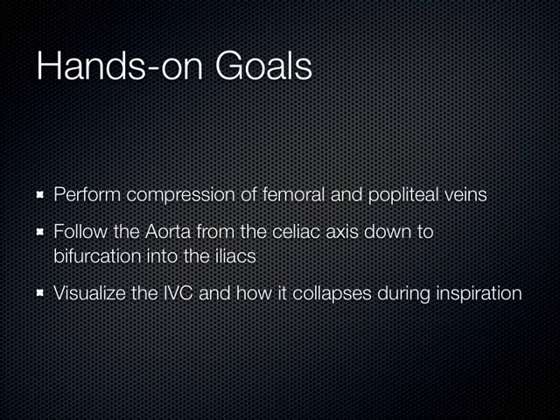Okay, so today, with the hands-on session, we're going to do compression of the femoral vein and the popliteal vein, okay? You'll see how fast this goes today. It's going to be a pretty quick scanning session, I think, because you're just compressing the fem area, and then you go down to the pop, and then you're going to follow the aorta down until it bifurcates, and then I want you to look at the IVC and how it collapses during inspiration. That's about it. If you want to move on and ask other questions, you have time left in your group, by all means, scan whatever you want today. Use it as a free scanning session to tighten up wherever else you have questions, heart, whatever it is you want to do. But really today, it's the DVT, aorta, and IVC.